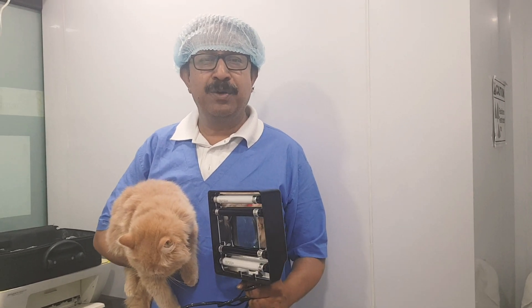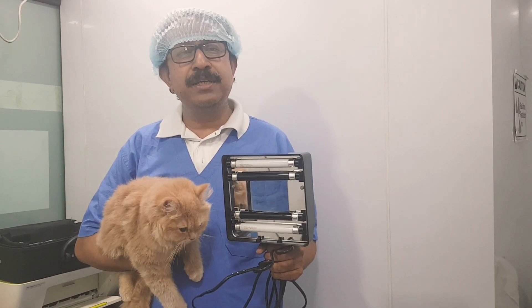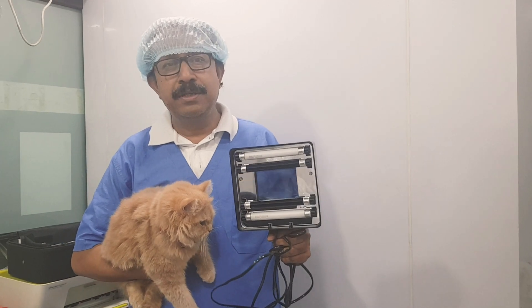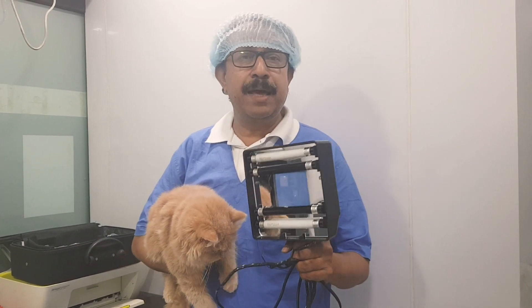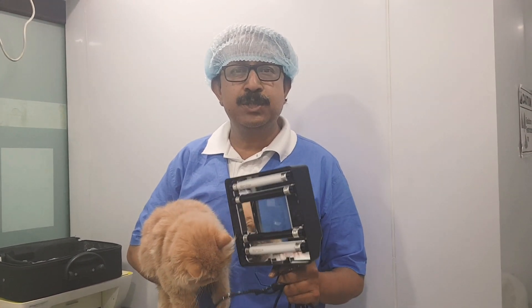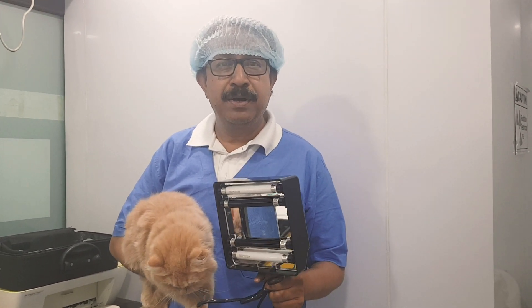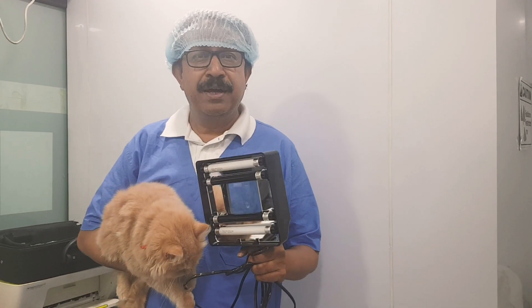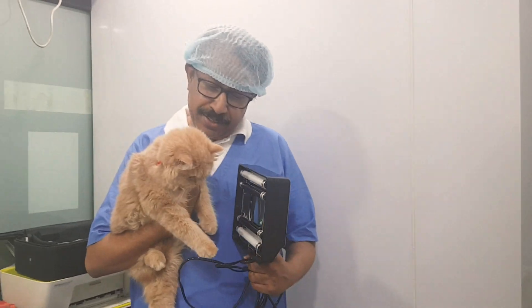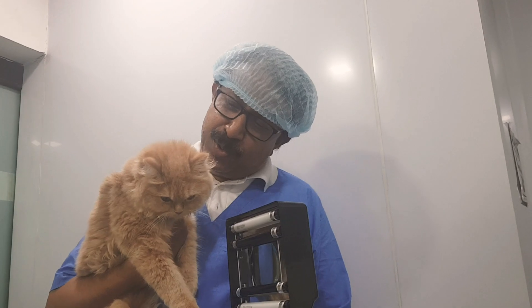I have seen many of my veterinary friends not using this most important tool — the Woods lamp. I am requesting them to please use this Woods lamp in their day-to-day practice. Today I'm going to tell you what it is and why we have to use it. This is Sarah — she has no infection on her body, but she is here just for demonstration purposes.